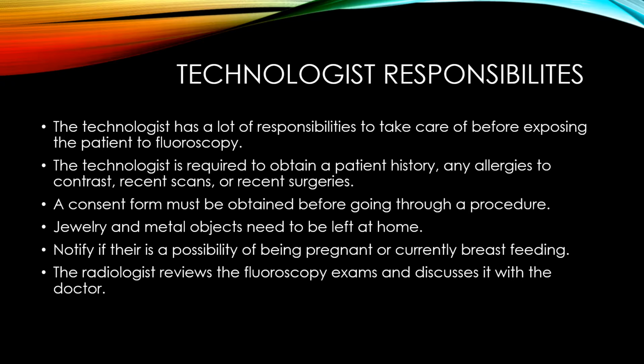The technologist has several responsibilities before performing fluoroscopy on any exam. The technologist is required to obtain a patient history, any allergies to contrast, any recent scans or recent surgeries. A consent form must be obtained before going through any procedure. It's required that jewelry and metal objects, if applicable, be left at home or in the patient room. The technologist must confirm an HCG depending on the female's age and if the patient is currently breastfeeding.